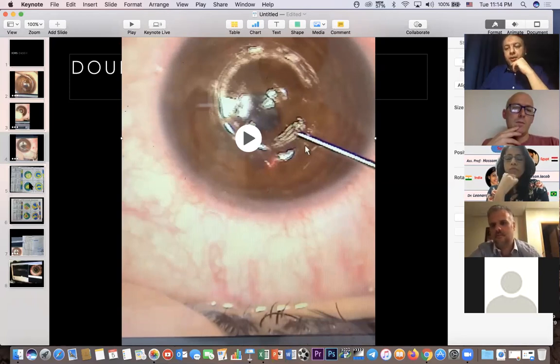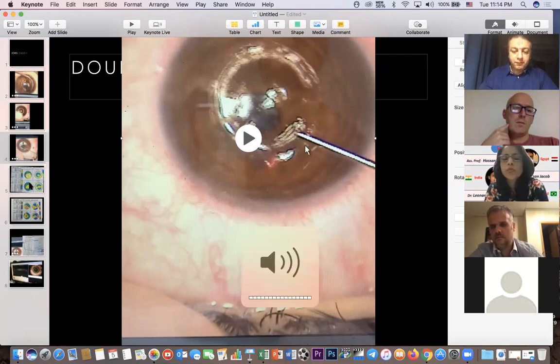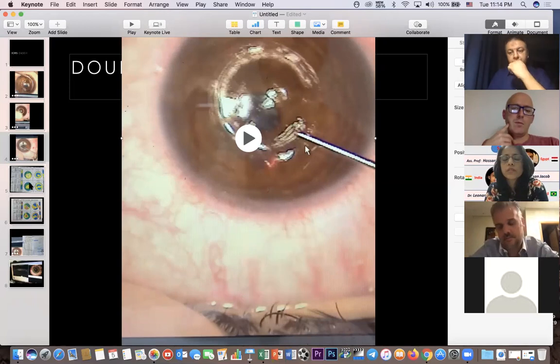Okay, starting with Dr. Soosan. I think it's basically the cone and everything that decides the spherical equivalent, the cylinder, the astigmatism, the position of the cone. All these things would dictate what kind of segments you use.